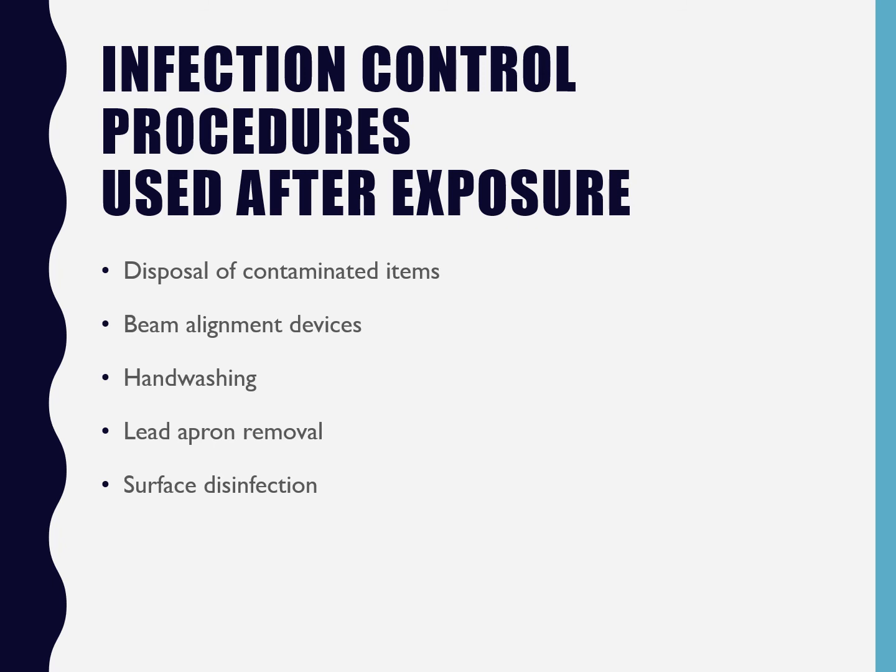That'd be cool too. With a sensor, you take the barrier off and then you spray wipe spray for the sensor and then you just put it back on there. We'll talk about that a little bit more later as well. But I want you to be aware that everything in that room, first the barriers come off, then you clean everything, and then you leave it clean.